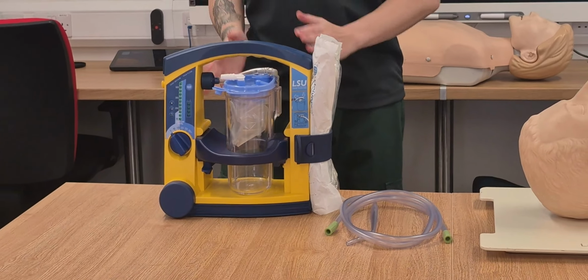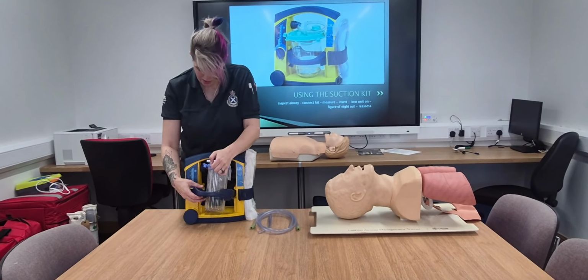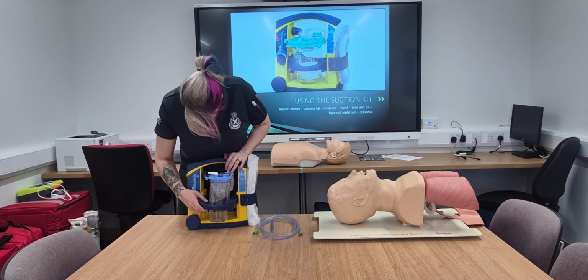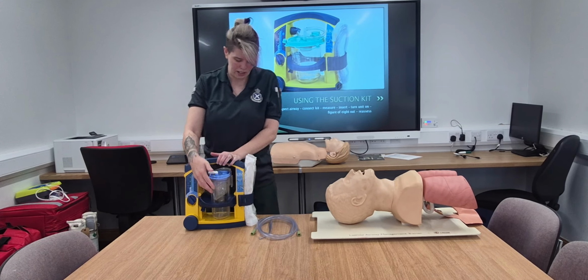If you find that the suction unit gets a little bit dirty as well, you can actually remove this whole section here, like so, and give it a right good wipe down, which you guys should be doing fairly regularly, or certainly after each job. That's it, instead like so, nice and easy.